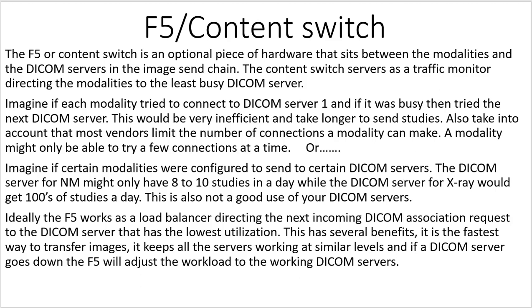Or, imagine if certain modalities were configured to send to certain DICOM servers. The DICOM server for Nuke Med might only get 8 to 10 studies in a whole day, while the DICOM server for X-ray would get hundreds of studies a day. This is not a good use of your DICOM servers. It's not a good way to balance the load.